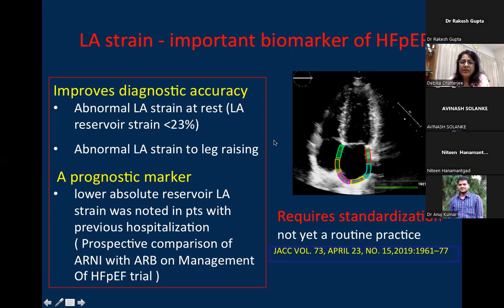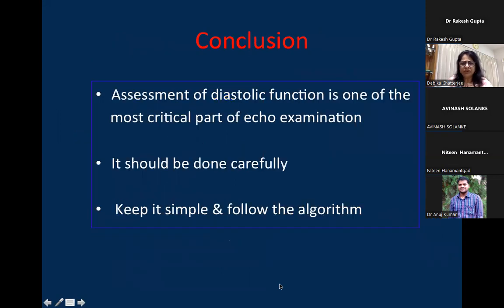However, this particular criterion is in the advanced stage of research, though it is not yet a routine practice. It is the method of the future, so you must know it. And there are machines in some of the labs where we are doing it regularly, but we'll have to wait till it comes to routine practice.